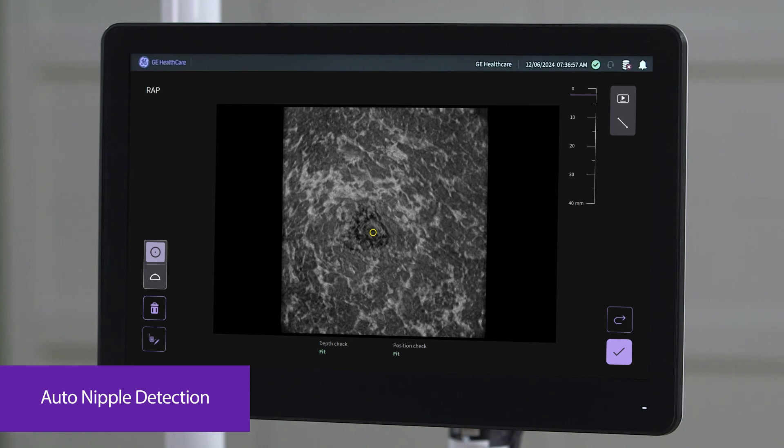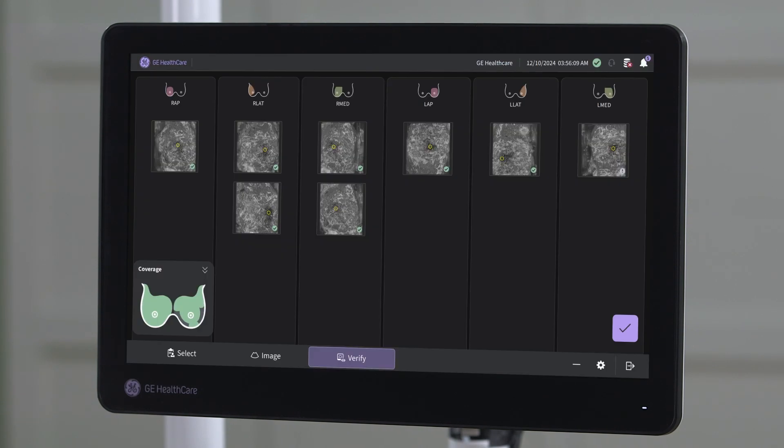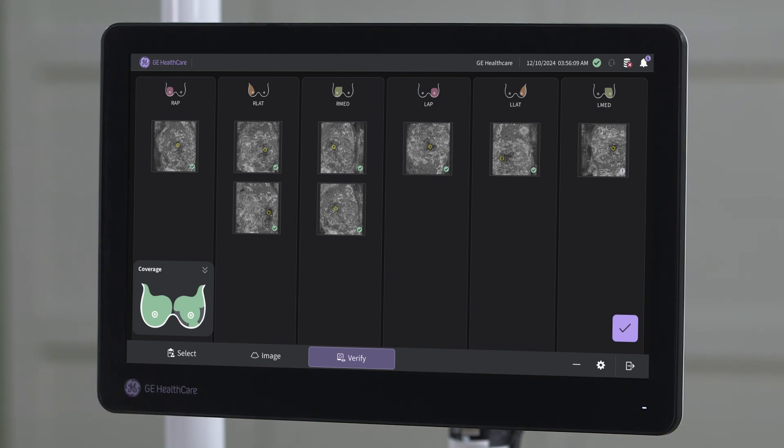Auto-nipple detection, enabled by Verisound AI, automatically offers the positioning of the nipple marker to provide consistency within the breast volumes and speed up the overall exam time. A further AI feature, the so-called scan quality assessment, offers an immediate qualitative evaluation during the exam for proper breast coverage, depth setting, and positioning to make your staff feel confident.